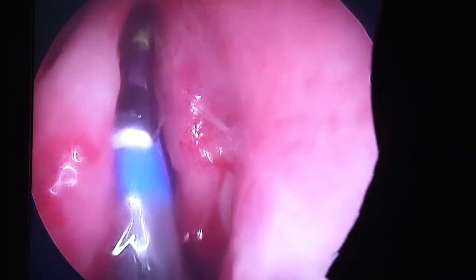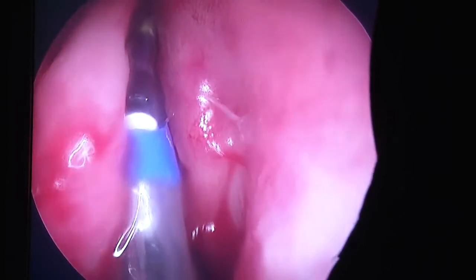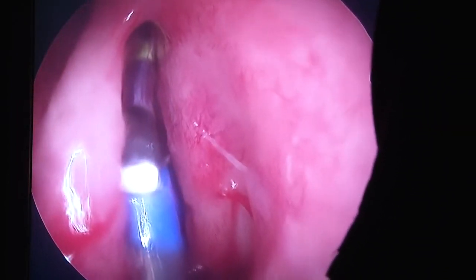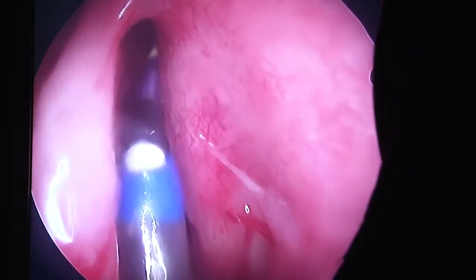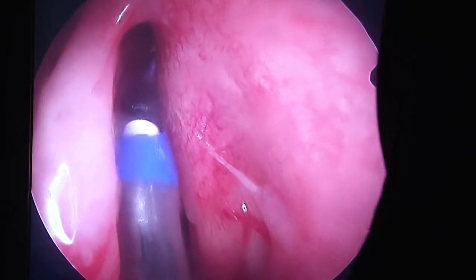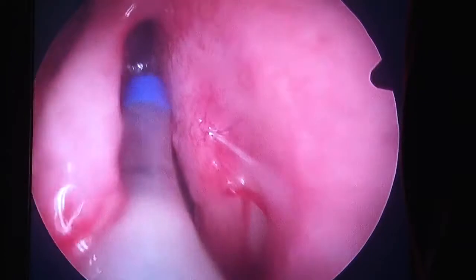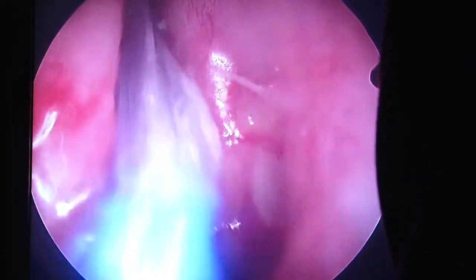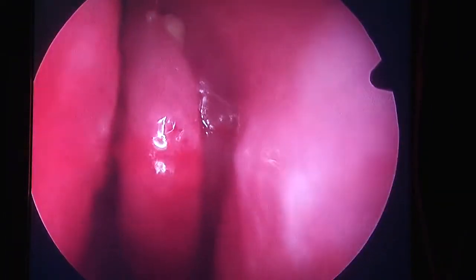Here comes that little bit of pressure that we talked about. When it inflates, you'll feel that little bit of pressure in that sinus. As soon as it's inflated, she's going to deflate the balloon and I'm going to take it right back out again. The balloon's coming out, and that sinus is done.